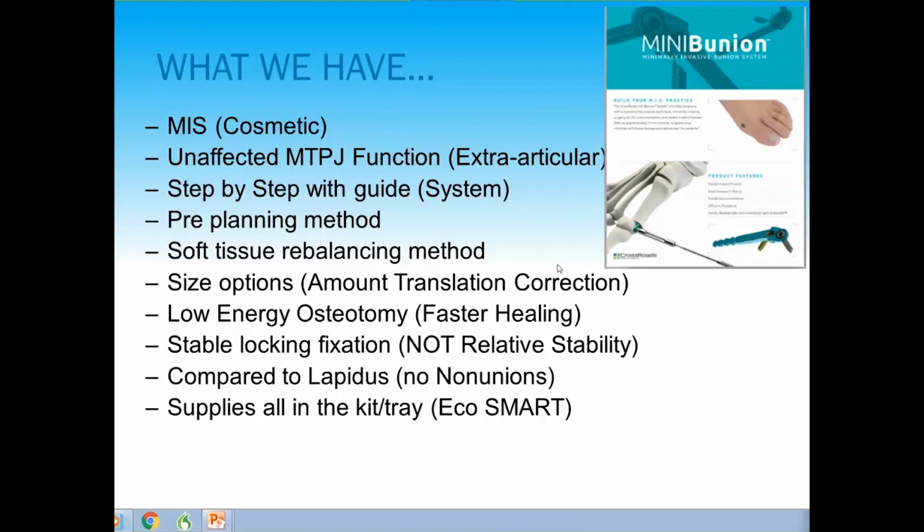There are, of course, patients that require that, or you think that adds to the correction of deformity, and I do employ the Akin osteotomy, and it's definitely something to use on the right occasion. But with this technique, utilizing both the accurate bone correction and the soft tissue balancing correction, I think it's a lot less commonly needed.